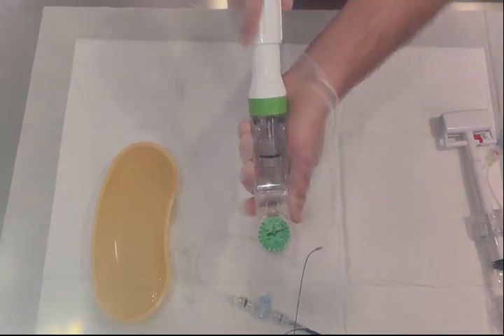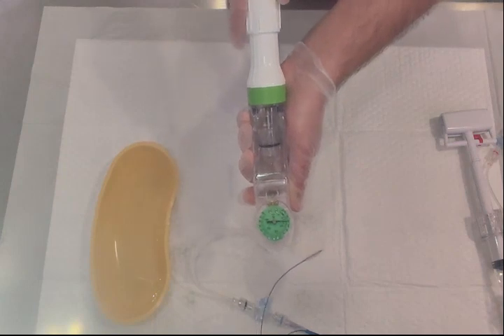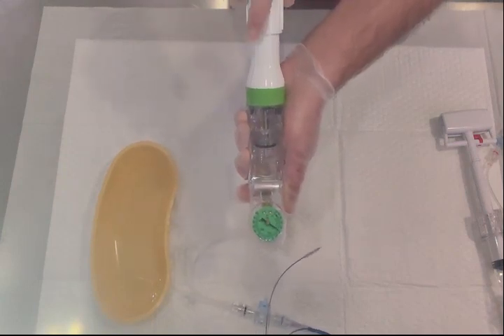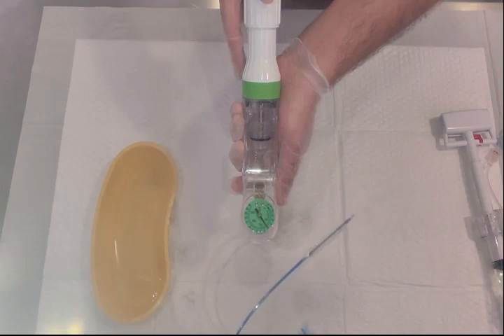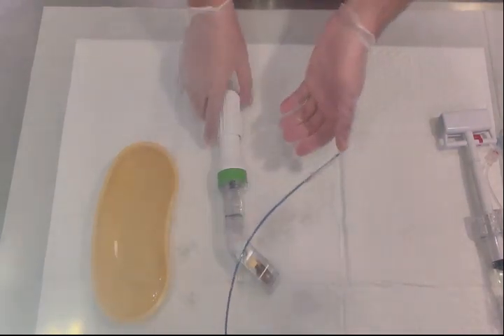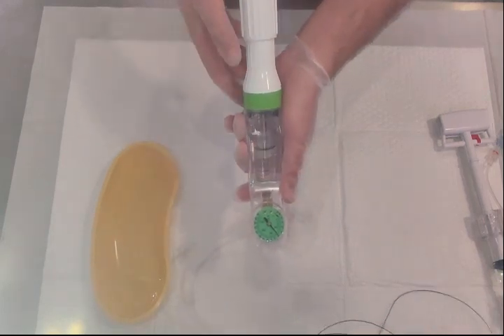Once locked, turn clockwise — you will see the meter going up, showing you the atmospheric pressure being applied. For example, if the doctor wants ten ATM of atmospheric pressure, continue clockwise. You can observe the balloon inflating as the pressure increases.